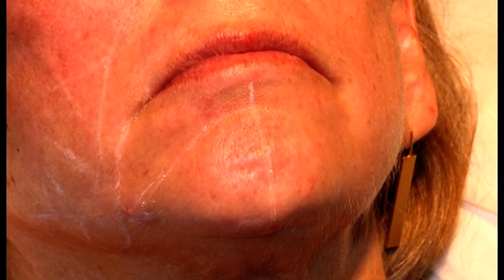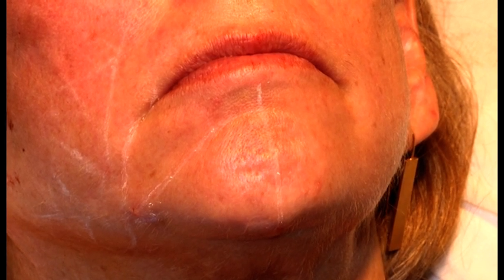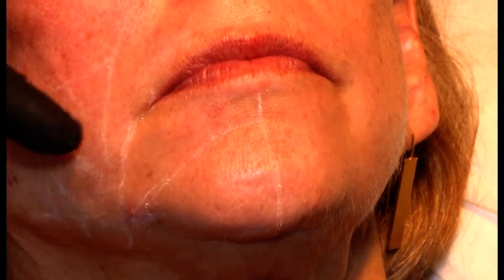Can I have the pre-hole needle? The gray one. Thank you. Okay. All right, one here.